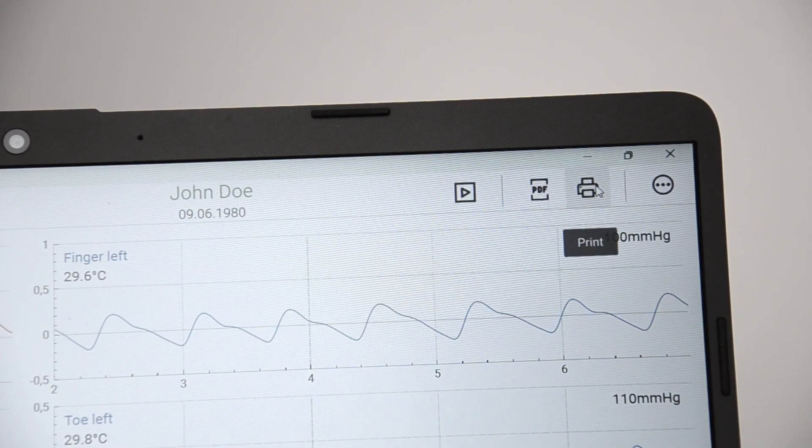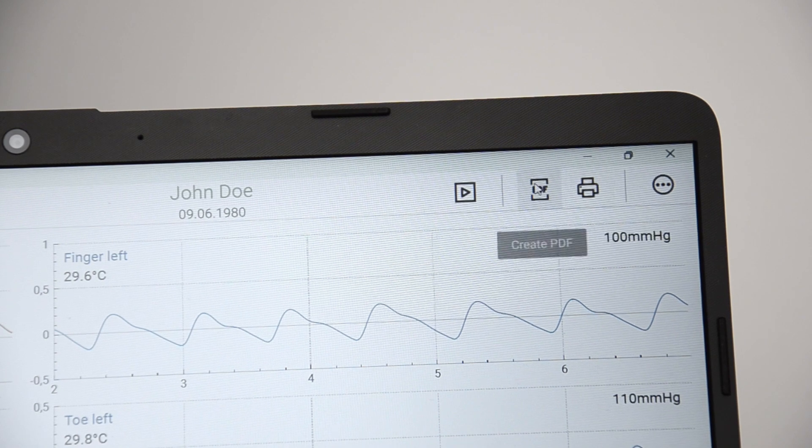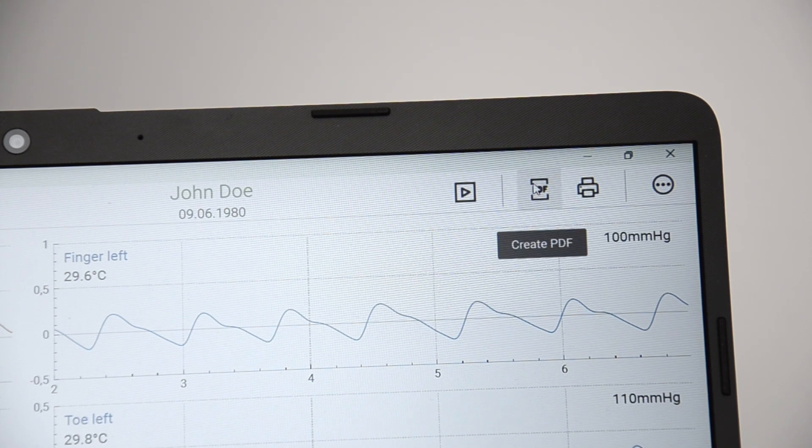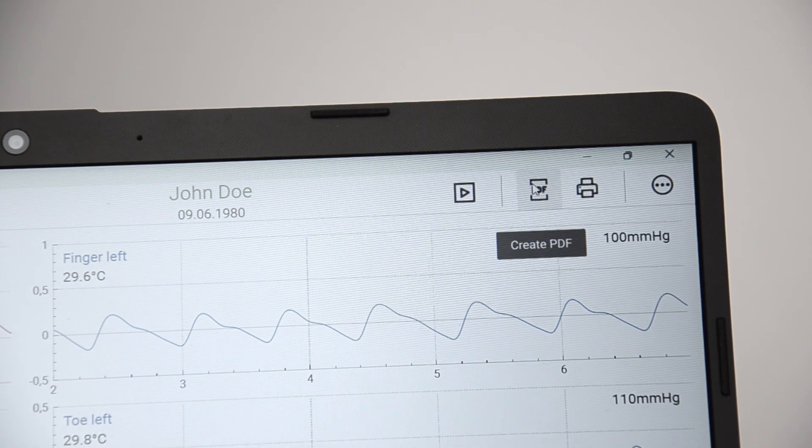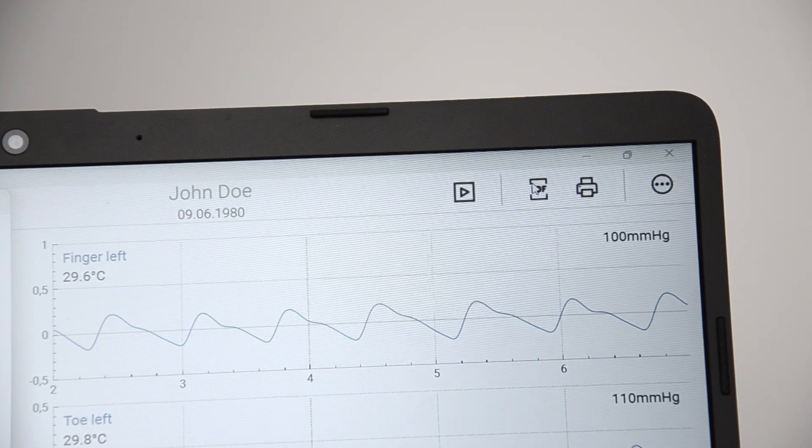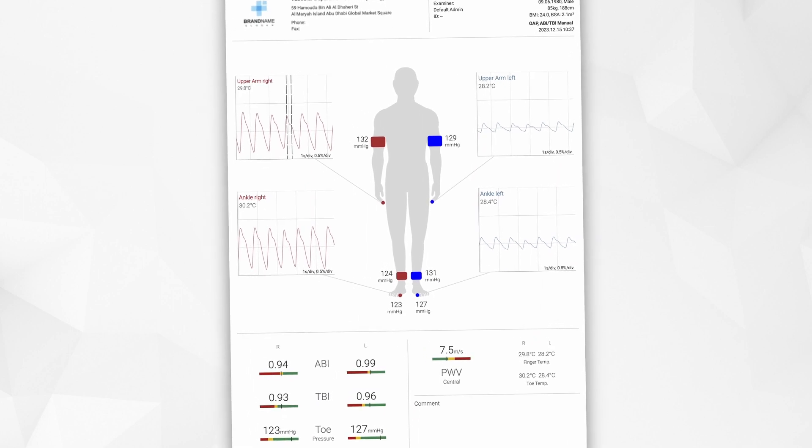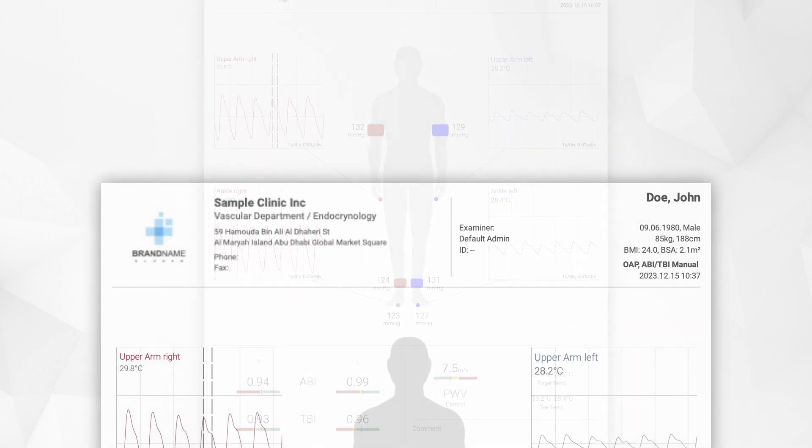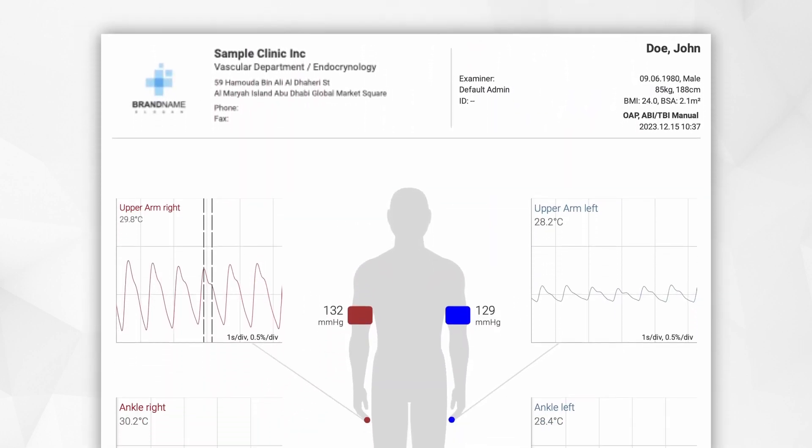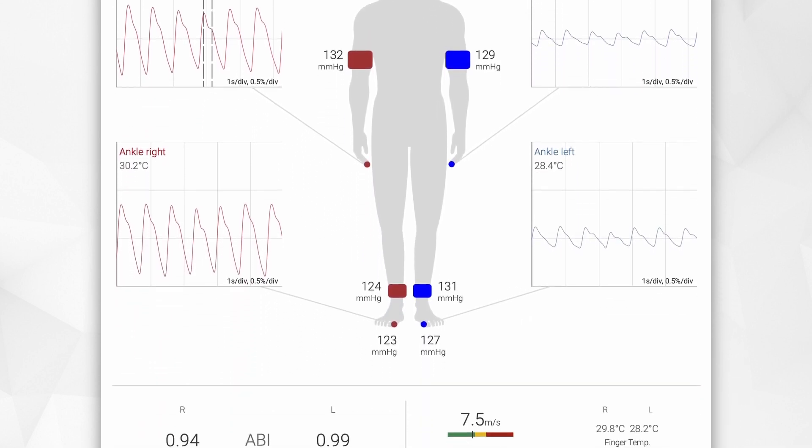You can directly print the report or export a PDF document. Optionally, a DICOM or HL7 interface can be configured. The results of the measurement are displayed in a single page report. It is easy to read and can be configured with your custom logo.